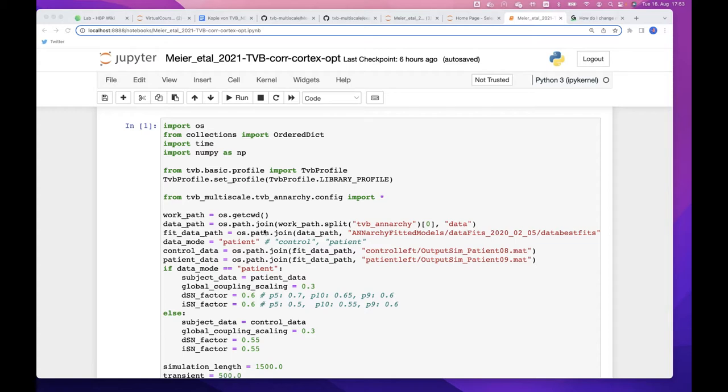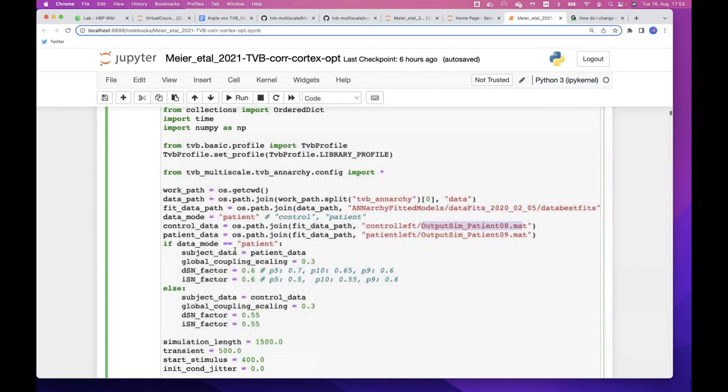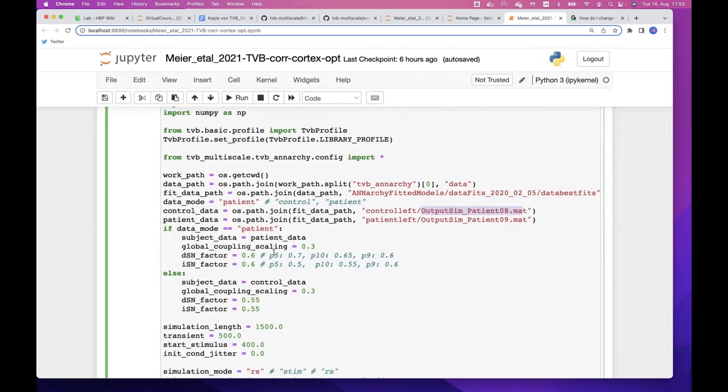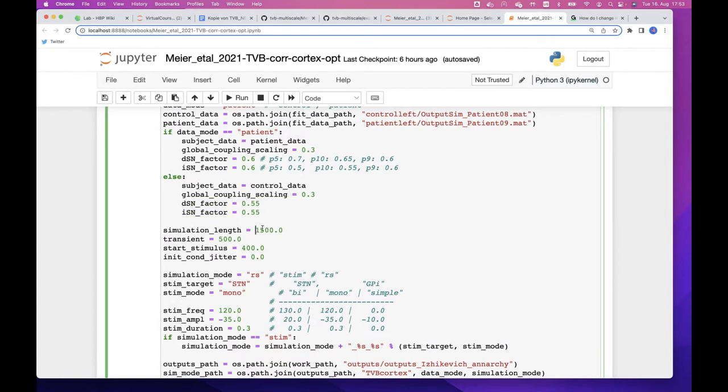All right, so we have some equations defined again for your convenience. We are using the spiking network of Izhikevich, and it's mainly the Izhikevich model about the membrane potential, and you have a recovery variable. So the first things are just importing a bunch of stuff, of course, setting your paths, where can I find the data that is also put online now. So the whole study is reproducible because all the data is online, also the optimized weights of this one control and one patient. So you are able to rerun everything here.